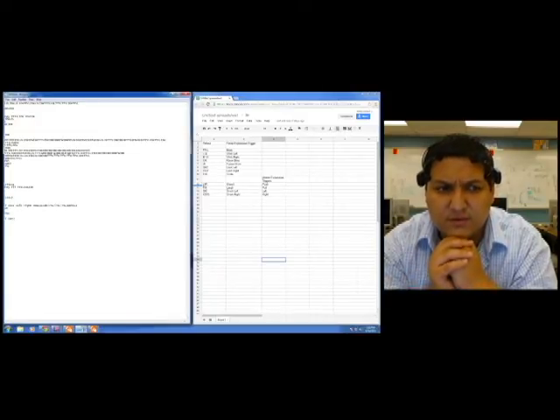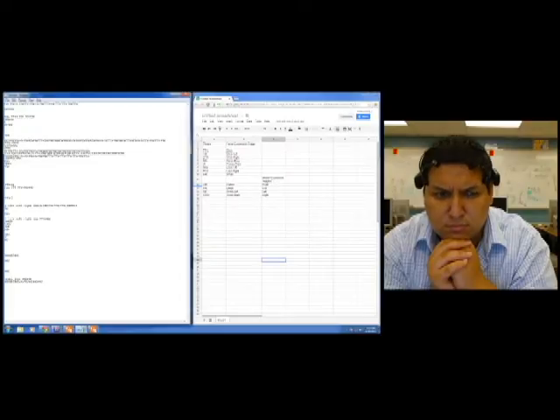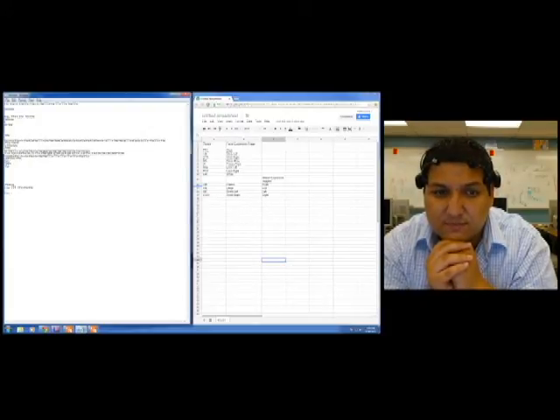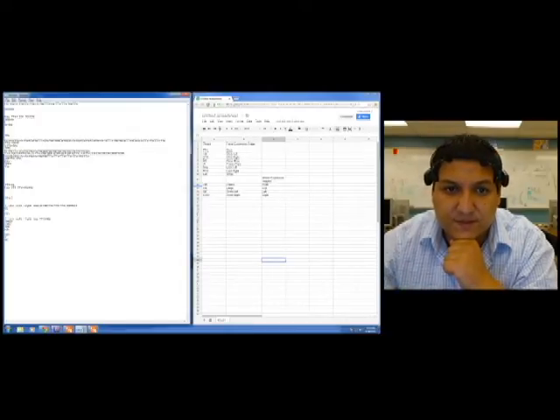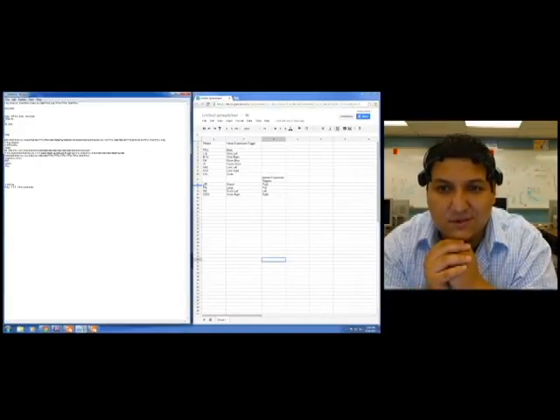Now furrow my brow — furrow brow is 'JK' — it's confusing it with the blink. Now if I wink right it should be 'by the way' — by the way — right there. Now if I wink left it should be 'LOL.' Now blink is 'talk to you later.'